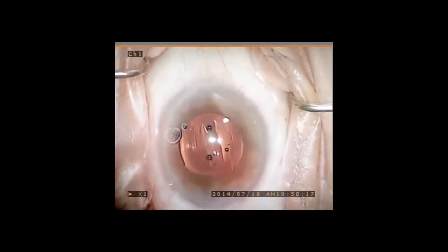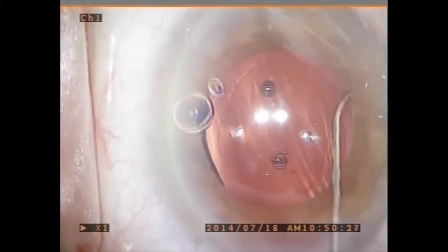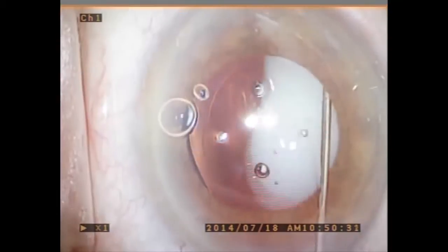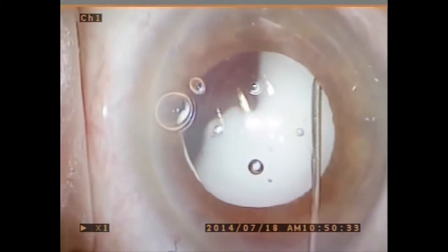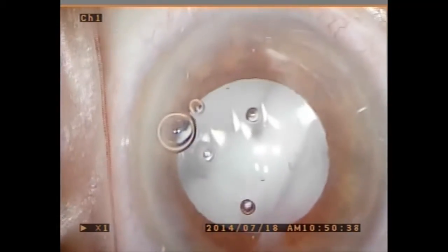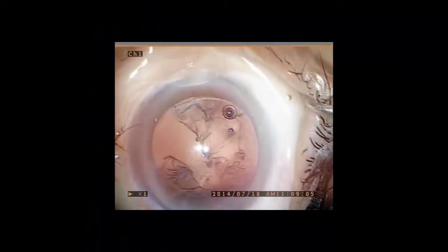A Rycroft 30-gauge cannula is advanced into the sulcus through the zonules by posteriorly rotating and slightly depressing the tip of the cannula. 0.2 cc's of Trimoxy Vanco is infused into the vitreous. Confirmation of proper placement is achieved when the plume of TMV is seen in the vitreous.